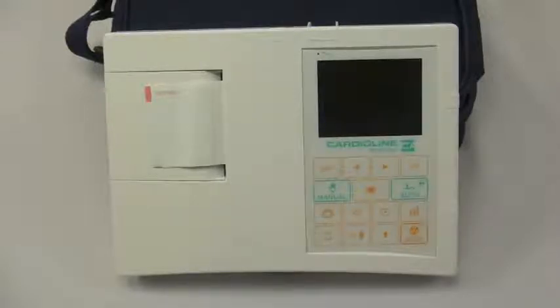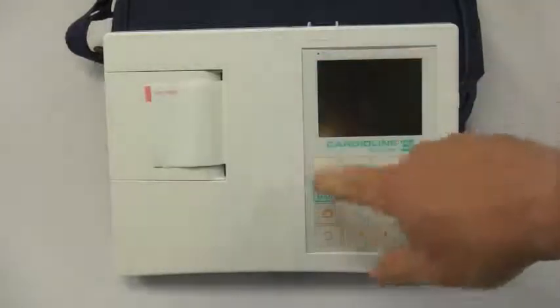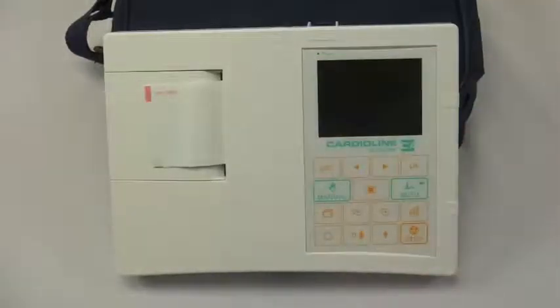The machine in front of you is the CardioLine AR600 VIEW — VIEW meaning it has a preview screen and allows you to view the waveforms prior to printing.